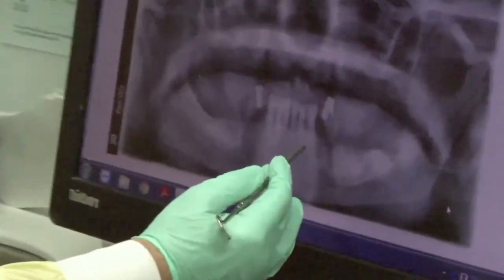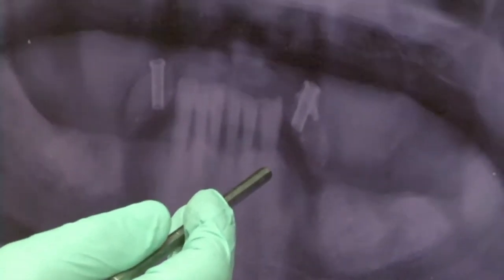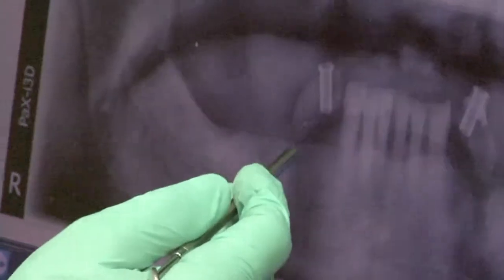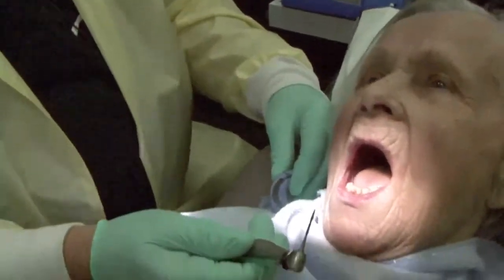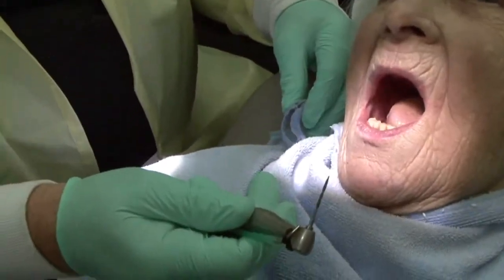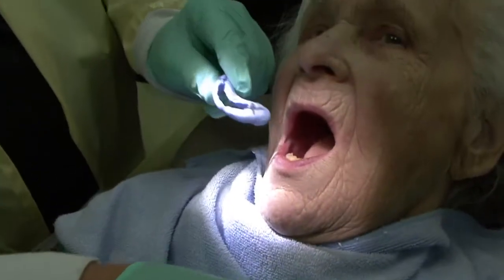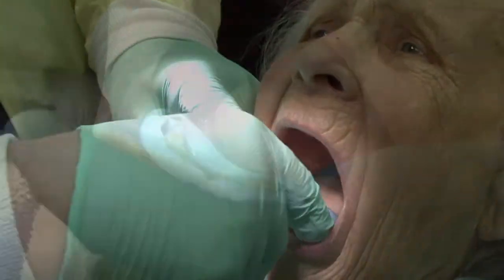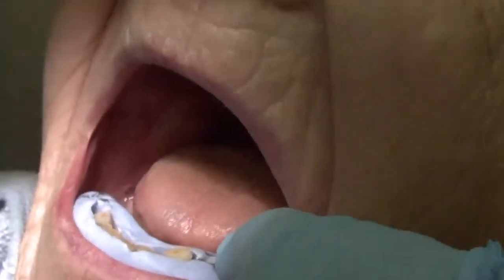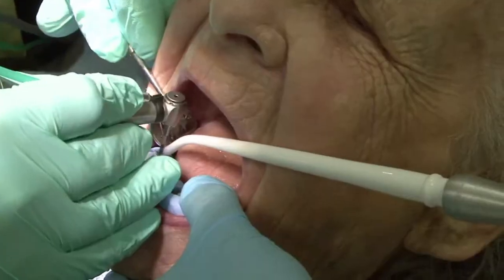On the left side, you can see an extraction was done in this area. There is good bone fill, but not nearly as nice as it is on the right side. We'll see more of this when we flap the soft tissues. This is the needle drill. This is the drill that we're going to use to make a marker through the skin and into the bone. We're going to place this little guide back in the mouth. We're drilling at 600 RPM, and we're going to stay parallel and in the middle.